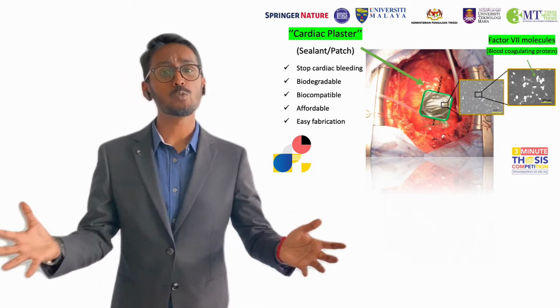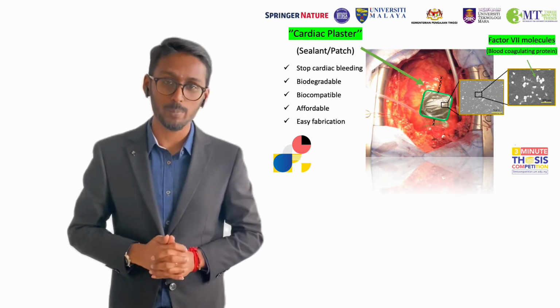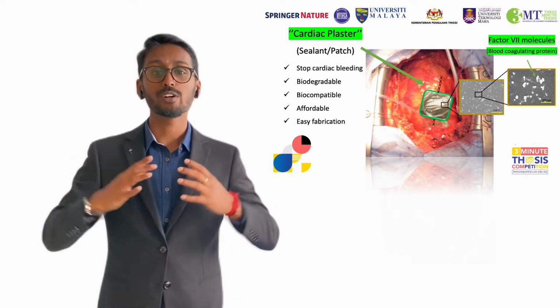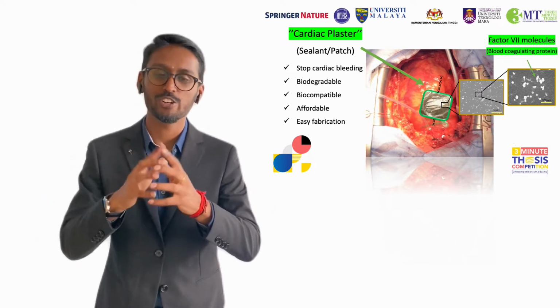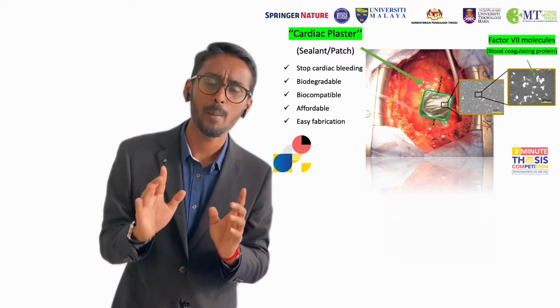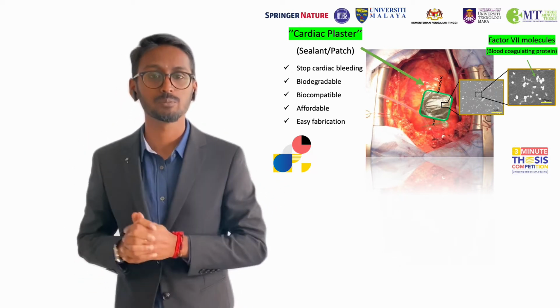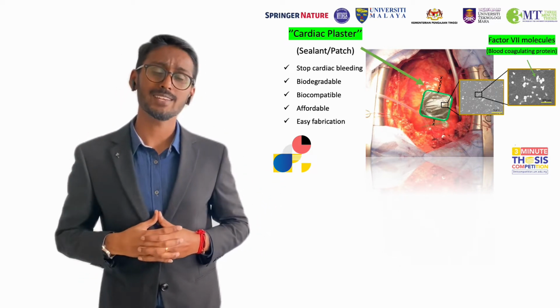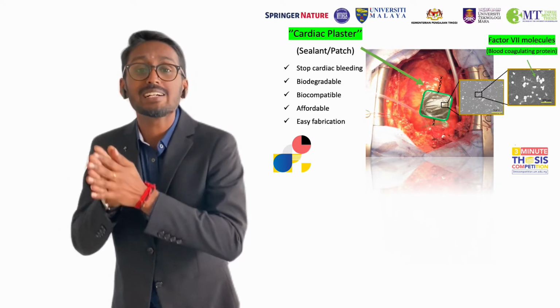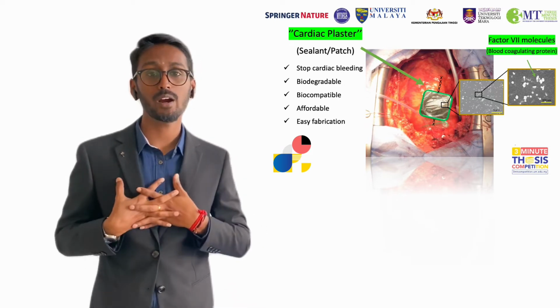We are familiar with patients undergoing open heart surgery due to severe heart problems. This means that to operate, their chest is cut open for direct contact on the heart to treat the disease. Now bear with me, it already sounds terrifying, but what makes it worse is the complications that follow the surgery. Would you believe me if I say that there are some cases where the patients are rushed back to the operation theatre again after the surgery due to the bleeding complications from the heart?